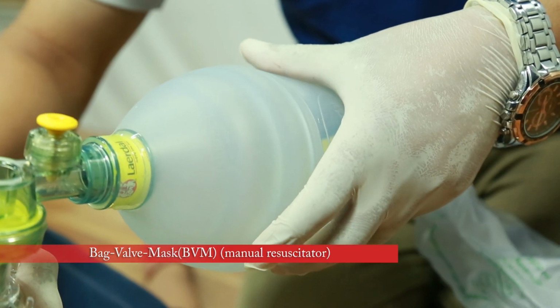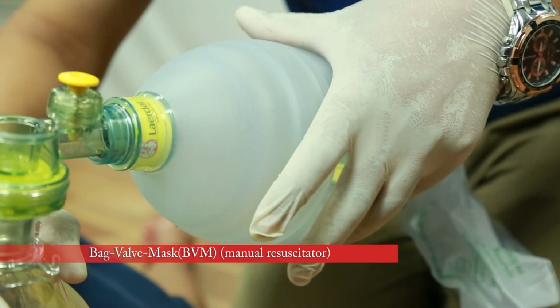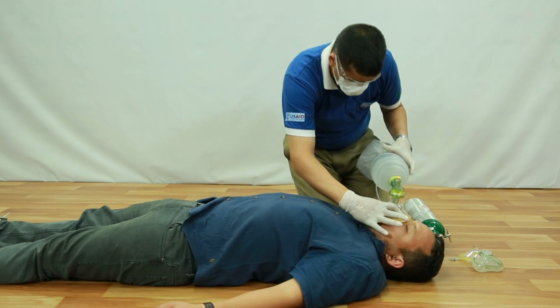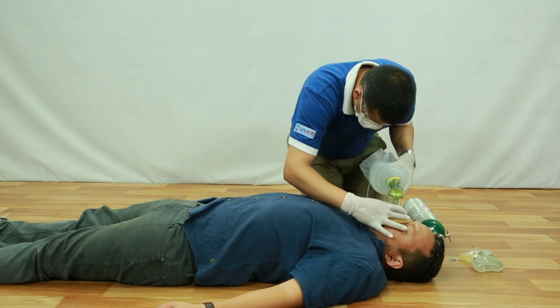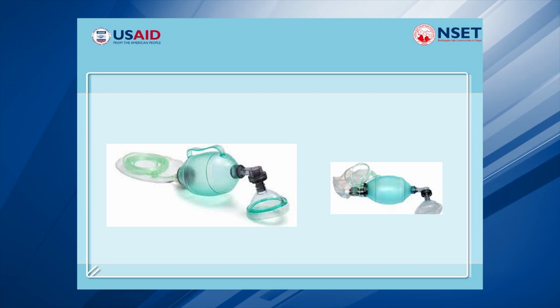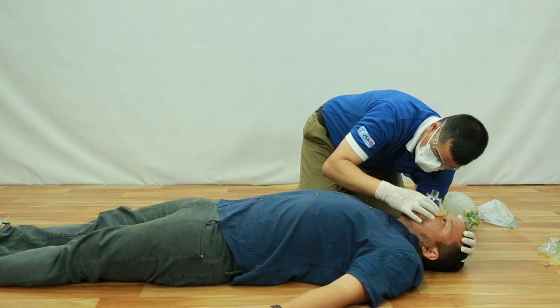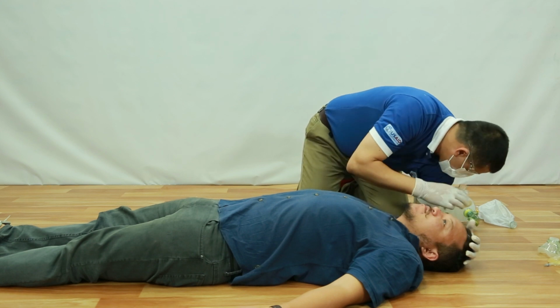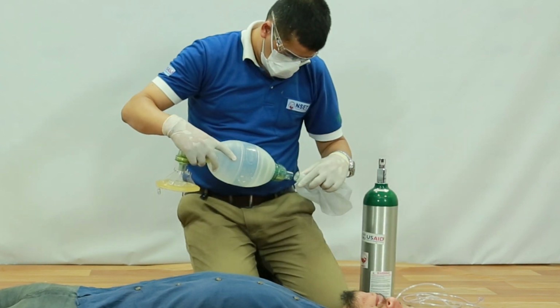Bag valve mask (BVM). Manual resuscitator. The bag valve mask is a handheld device you squeeze to ventilate a patient. It comes in adult, child, and infant sizes. All have the same basic parts: face mask, non-rebreather patient valve, a bag, rubber or vinyl.